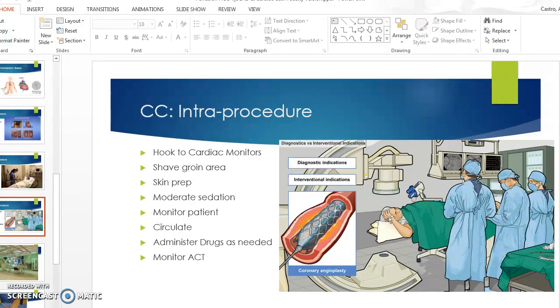If you're not the nurse that did the pre-procedure teaching, then when the patient gets to you in the cath lab, you do a quick head-to-toe, you check pulses, and peripherally, you do the Allen's test. You would do those right when the patient is laying on the table like this in the cath lab. And so we've communicated our assessment findings to the physician.